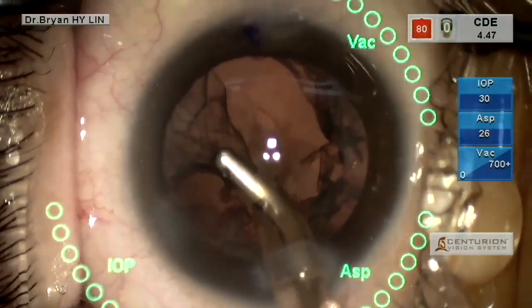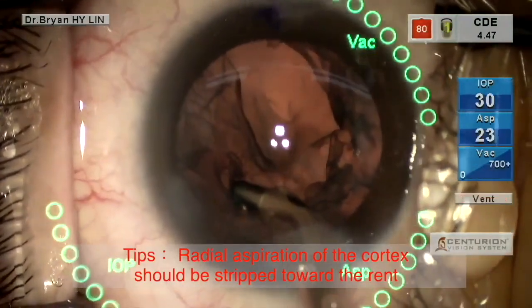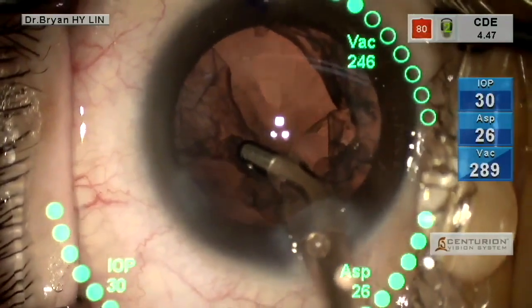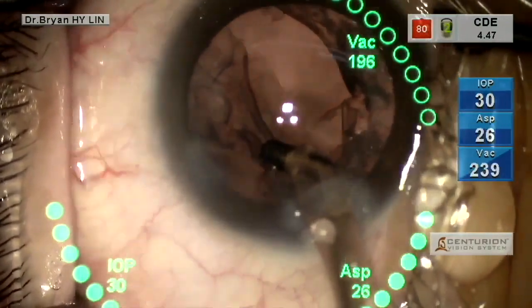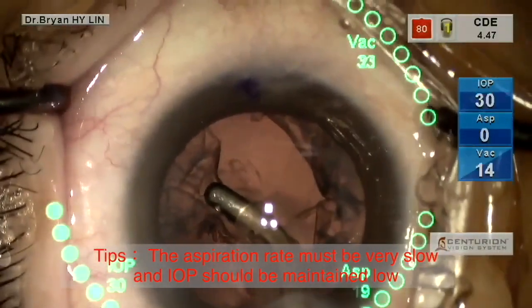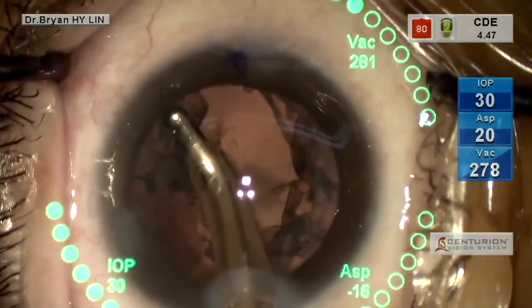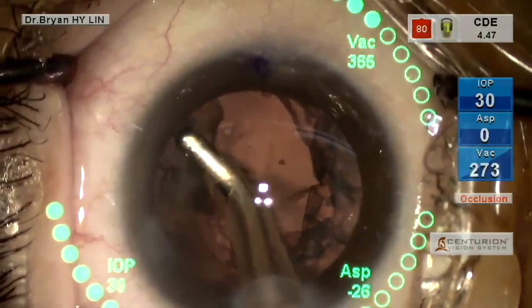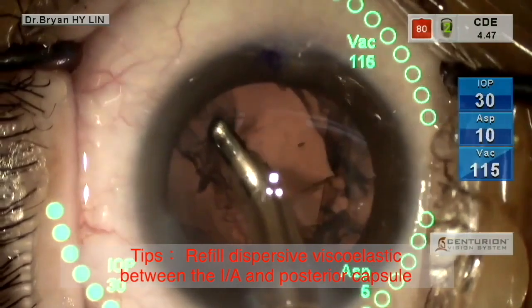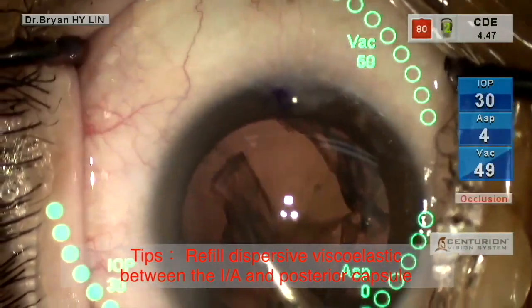Tips for removal of residual cortex without extending PCR. First, radial aspiration of the cortex should be stripped toward the rent. Any force generated away from it will cause its extension. Second, the aspiration rate must be very slow and IOP should be maintained low to prevent pressurizing the anterior segment and driving the cortex into the vitreous cavity. In addition, be sure to refill dispersive viscoelastic whenever there's not enough tamponade between the IA and posterior capsule.